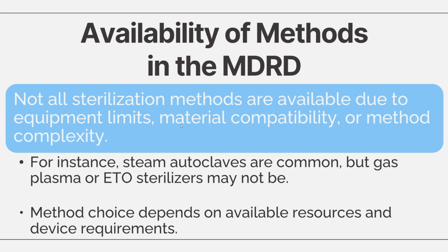As you remember, last class, I mentioned that you have to be in full PPE when working with ETO, and everyone has to constantly rotate if they've been exposed a certain amount of time. So it really does cost the healthcare facility a lot of resources. For that reason, facilities must balance device needs with what equipment and expertise they have. Sometimes the ideal method isn't practical, so validated alternatives are used instead.